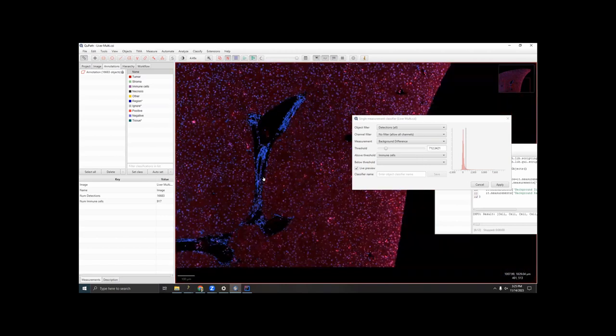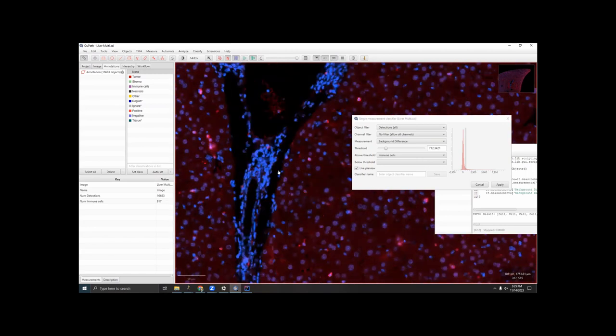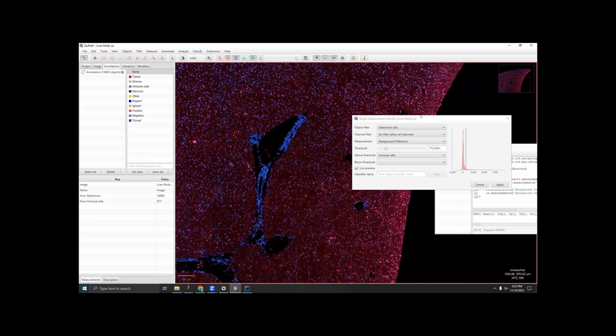Well, these vessels look a lot better, a lot more accurate when I'm using the difference instead of the ratio. So in this particular case, I would go with subtraction instead of division, though you really have to think about what's causing your artifact before you make that decision. That's not universally true.